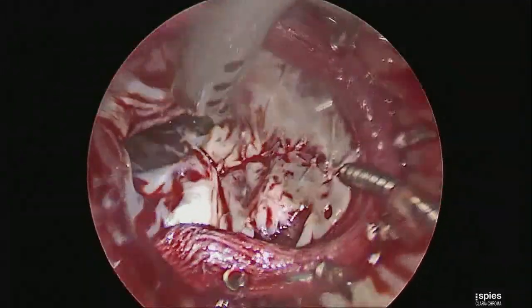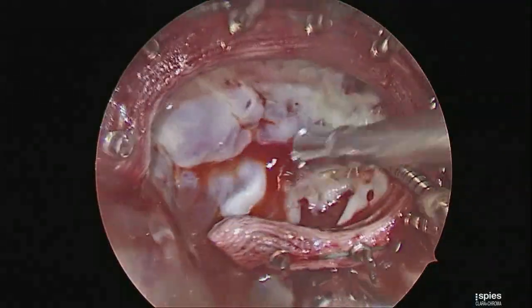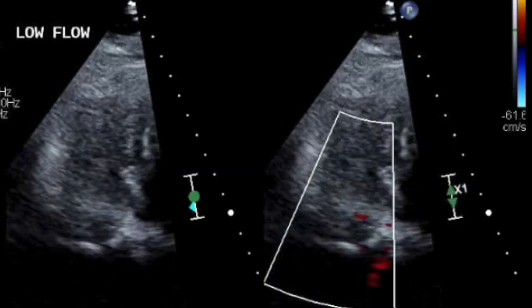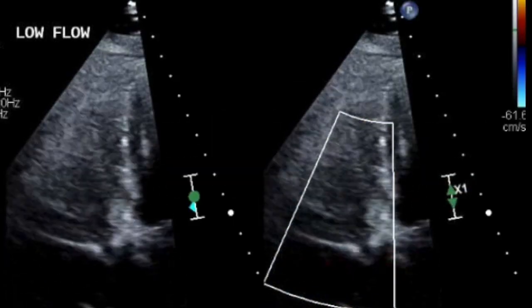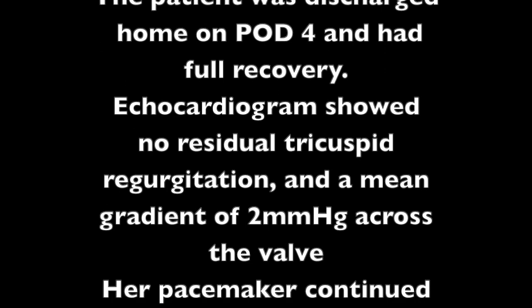The final result is shown. There is good coaptation and no leak of the valve on static testing. The atrium was closed. Postoperative echo showed 2 millimeters of gradient across the valve and no regurgitation. The patient was discharged home on postoperative day 4 and had a full recovery, with follow-up echo again showing good coaptation and no gradient across the valve.